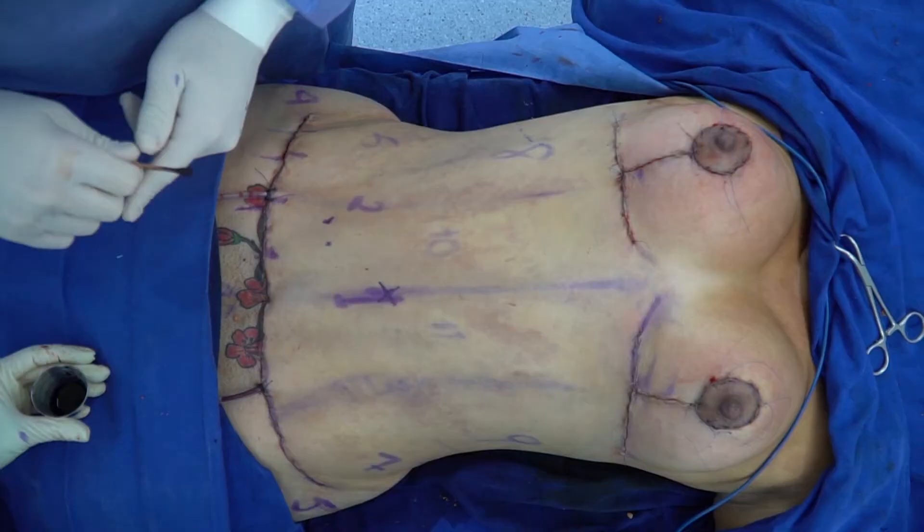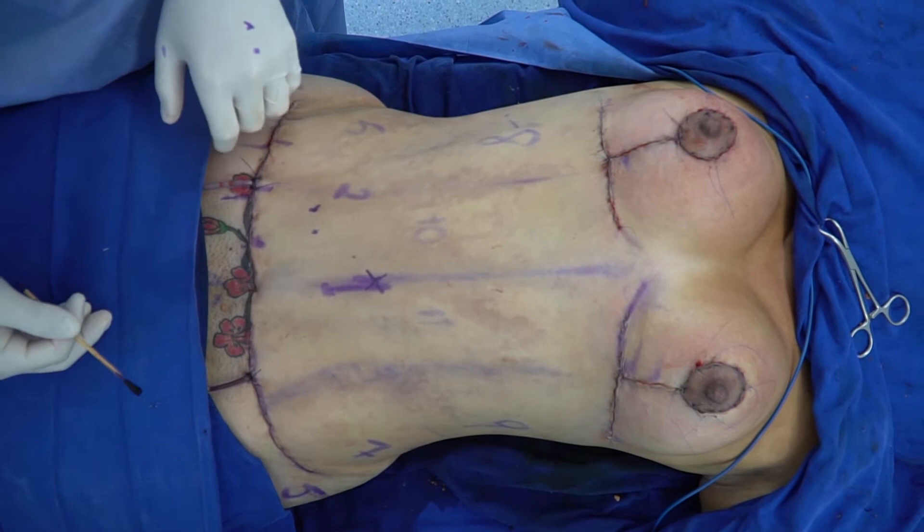We cut above the umbilicus because we are going to create a new one. And this is how we create the new umbilicus.